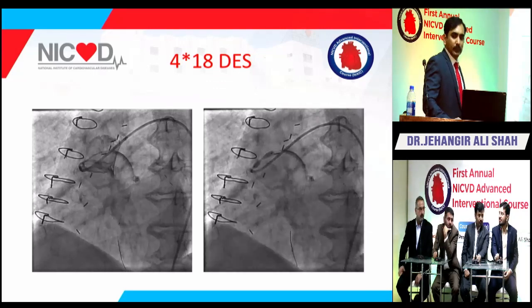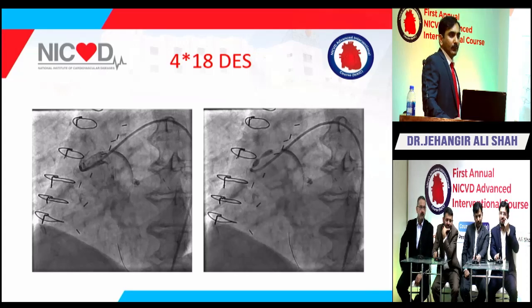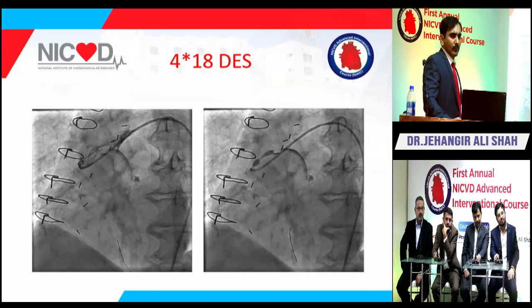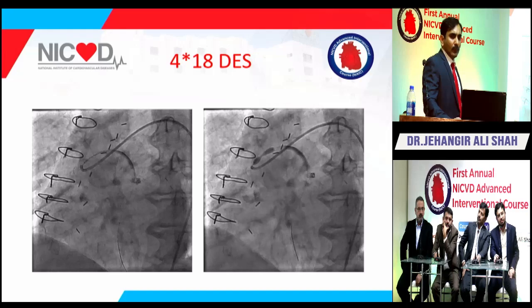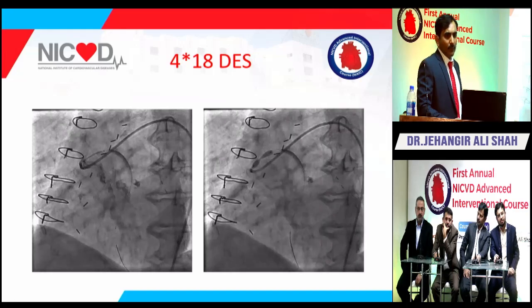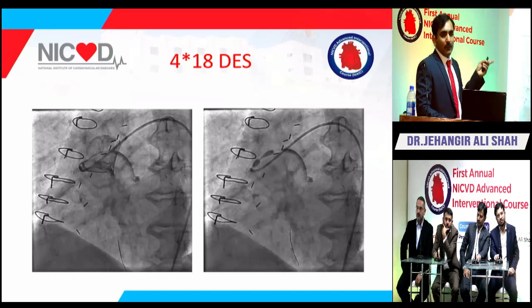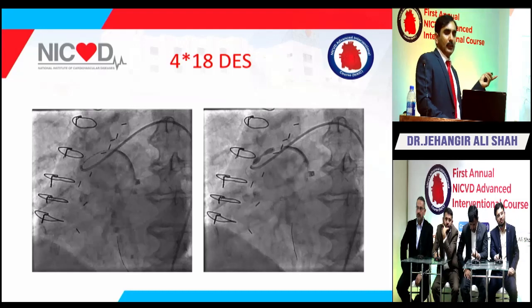I just want to add one thing. What is the difference from the case in the left main? It should be just outside the lower lip of the ostium. And in this case, when you are doing an SVG ostial lesion, there is no such landmark, so it's very difficult to localize the ostium of the SVG. You don't know, we have taken multiple directions to see.